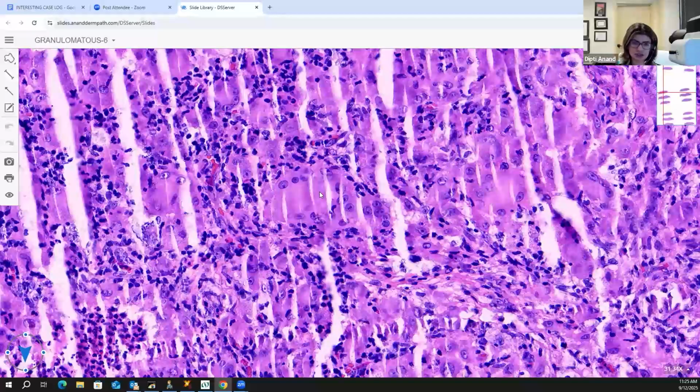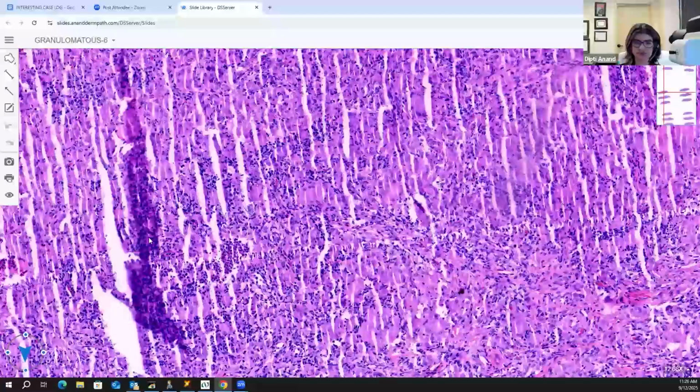So the degree of the Touton giant cells and the lipidized histiocytes may not be that prominent. That is why you can have early inflammatory proliferative JXGs, if you have heard those names. Whereas a reticulohistiocytoma, when you see it, you recognize it because all the cells have this, and they're not very multinucleated. They may be binucleated. What stands out is the denseness of the cytoplasm, and you never have this foaminess in it.